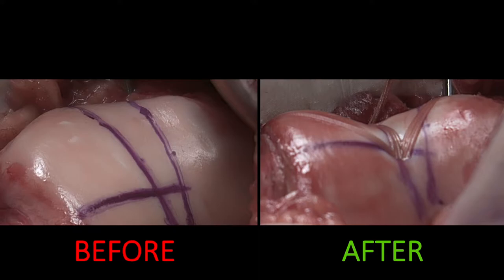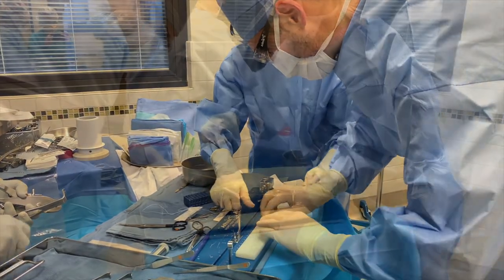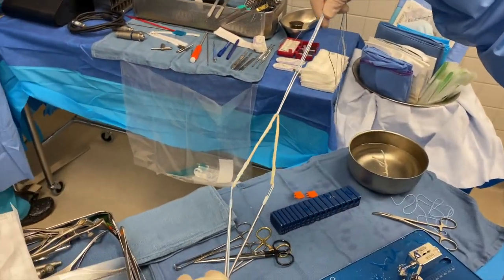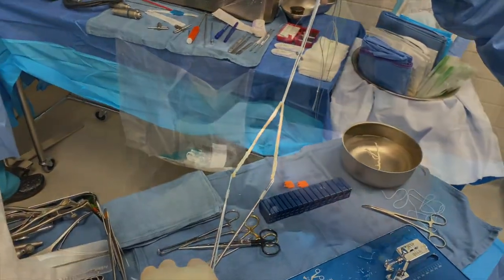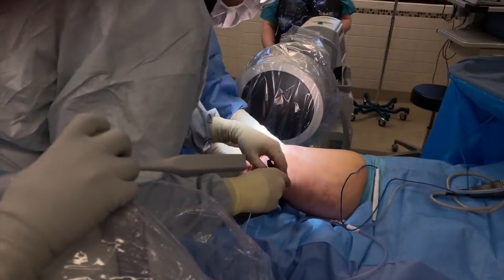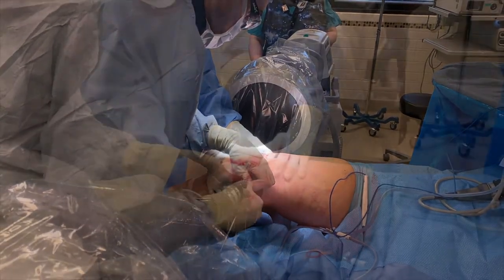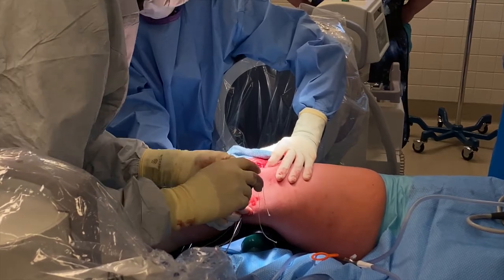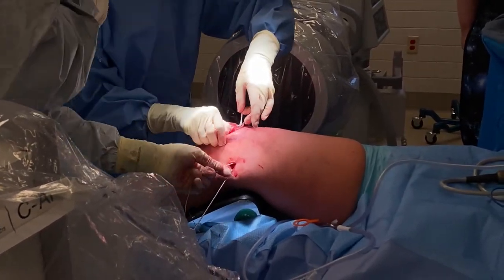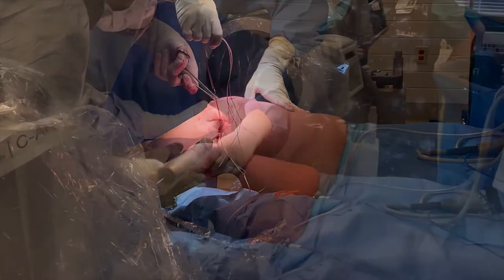Now that we have our new groove for the patella, we have to do some soft tissue balancing to allow the patella to track centrally in that groove. We do that by performing what we call a medial patellofemoral ligament reconstruction, or MPFL reconstruction, which will help keep the patella stabilized immediately. We secure two limbs of the graft into the patella under x-ray guidance, then shuttle the graft down to the medial aspect of the femur through a small incision and pass it into the end of the femur. This MPFL graft behaves like a check rein, preventing the patella from dislocating laterally.